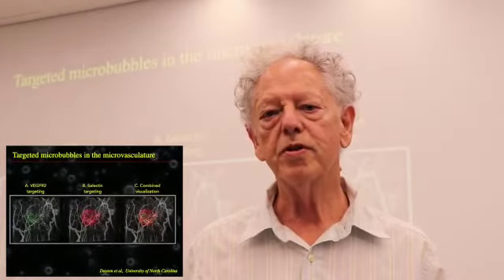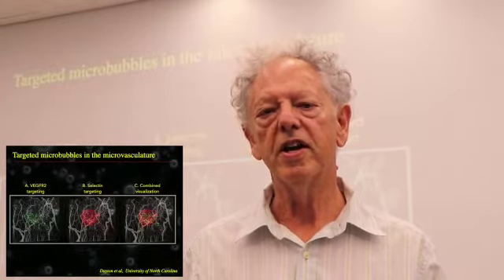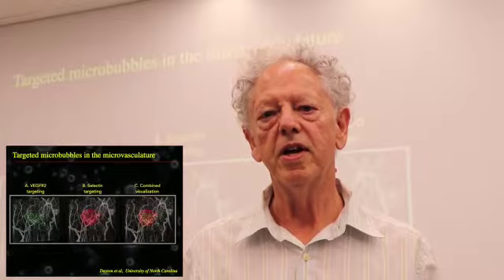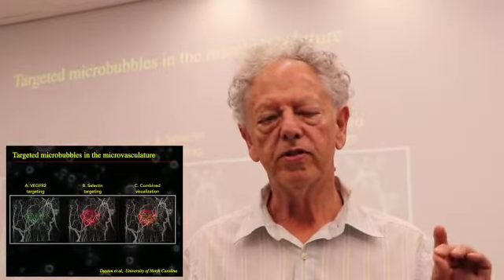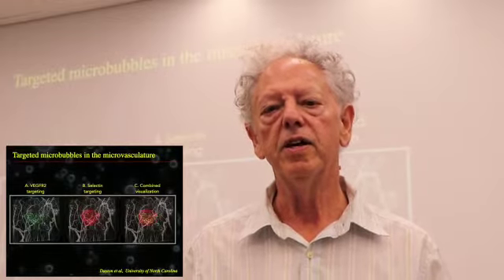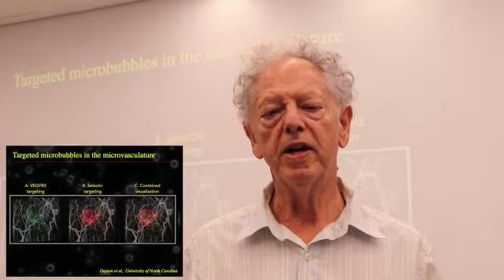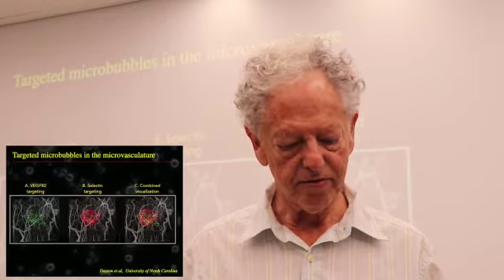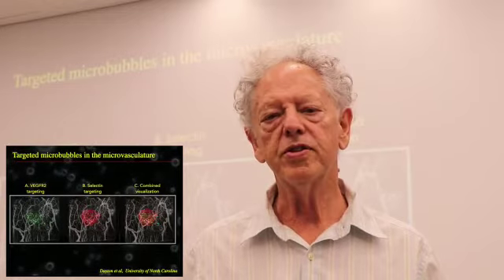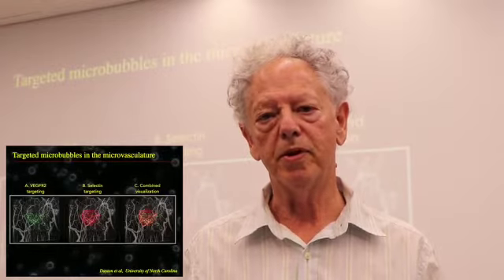Finally, we're going to be talking a little bit about the use of these bubbles, not simply to go round in the circulation and enhance the diagnostic ability of ultrasound, but also to add targets that will direct the bubbles specifically to areas of the body where, for example, there is a cancer developing, or where there is inflammation from ischemia, from the lack of blood flow. And here you can see examples of this molecular targeting of bubbles.